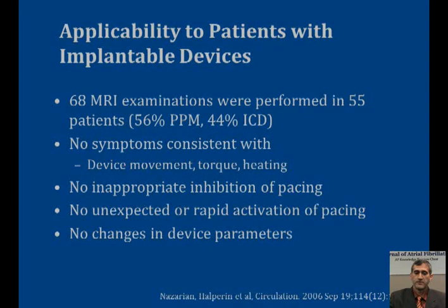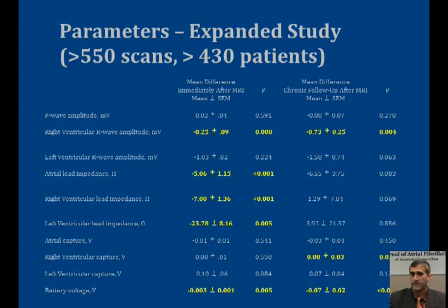Since that time, we've had the opportunity to scan over 430 patients, 550 scans, and what we found is that now we have the power to detect very small changes in lead parameters, although these changes are so small that they don't truly affect device function, and in no single case have we had to reprogram the device to deal with these changes. They're on the order of less than 1 millivolt for sensing in the right ventricle and less than 0.1 volt for capture threshold at a fixed pulse width.